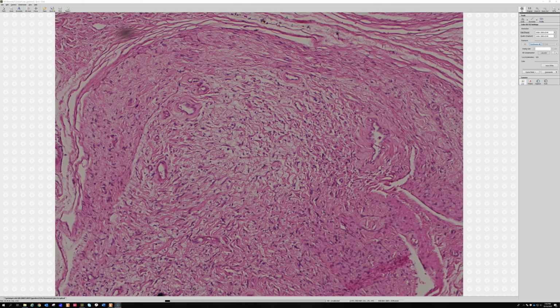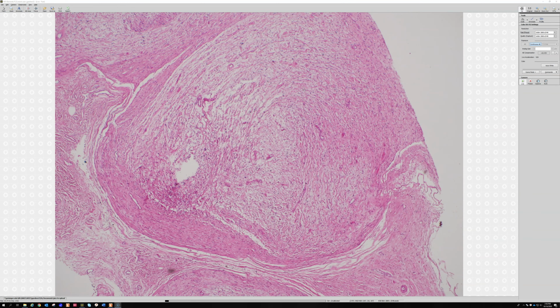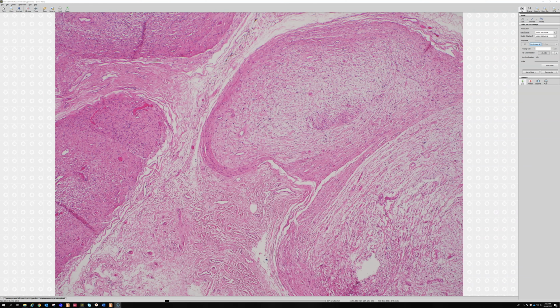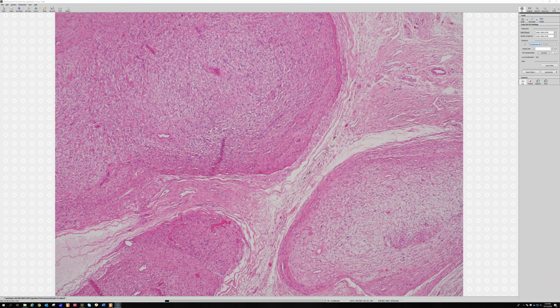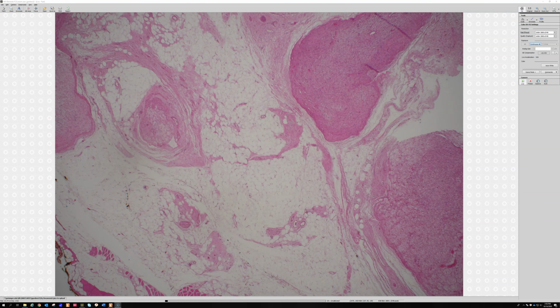You usually can't see the difference between those, but on staining we know that there are several different cells that go into a neurofibroma. And each of these used to be an actual nerve trunk that's been filled up and expanded by the growing neurofibroma inside of it. So these are actually individual nerves that are so distorted and blown out of proportion. If you do a perineurial marker, a lot of times you'll see EMA or GLUT1 or claudin around the outside. You don't have to do that, but if you do that stain, you'll often see that each of these are well-formed nerves that have just been grossly distorted by the neurofibroma. Okay? Sometimes you can also see background diffuse neurofibroma intermingled with the plexiform.